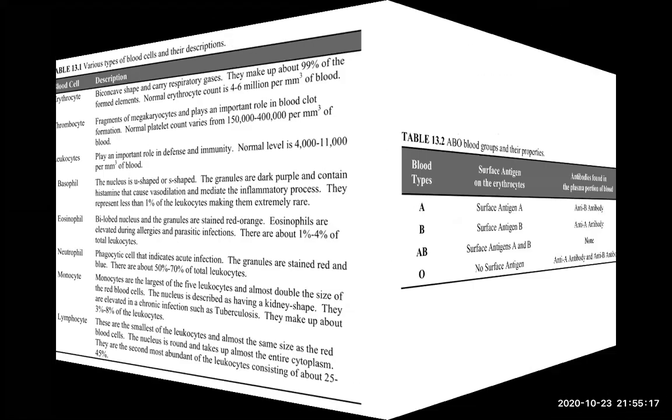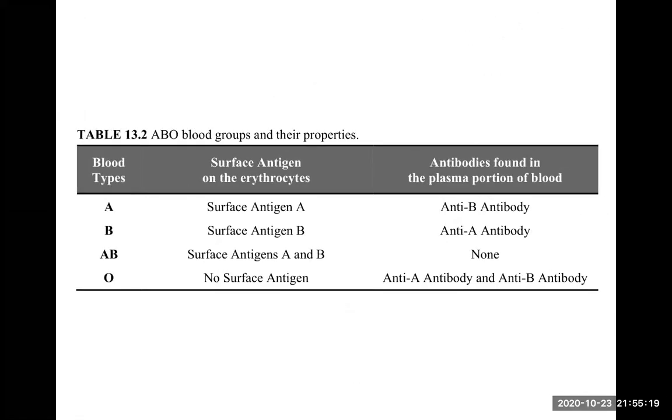So spend time in the virtual lab going over the practice for those different leukocytes, pictures similar to this, from your eLab. Also part of this lab, you'll have to identify the blood type of different patients with an external link. That's the second part of your Google Lab activity that you'll have to work through. I will provide you the link on the day of lab.